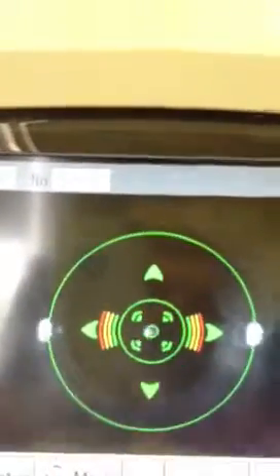Now we had a little lid on that, so we will probably take a new image. You can see the patient's lash, so we will take a re-shot — lash the patient, open their eye nice and wide, and we will go back in again. There it goes. And here is the data coming on screen. The mires look great — tell it okay. Mires, do they look good? Yes. Hit okay. Here comes the map.